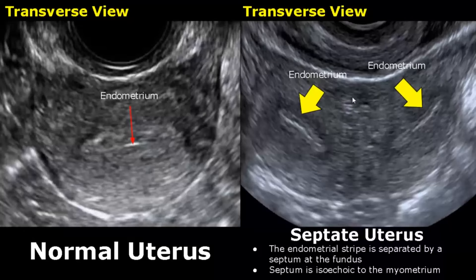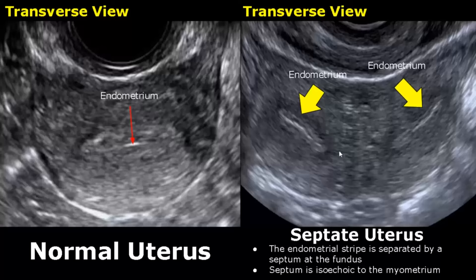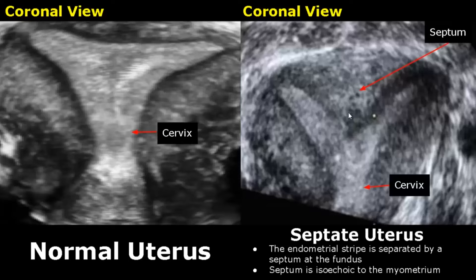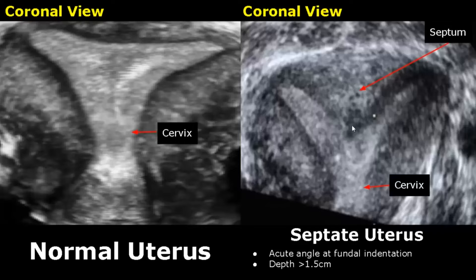In a septate uterus, the endometrial stripe is separated by a septum at the fundus. In transverse view, the septum has divided the endometrial stripe and is isoechoic to the myometrium. In coronal view, we can see a thick isoechoic septum in the middle of the uterine cavity. There will be an acute angle formed at the fundal indentation, and the depth of this indentation will be greater than 1.5 centimeters.